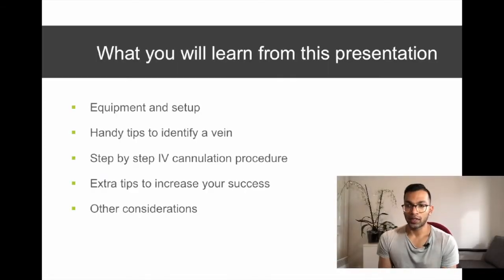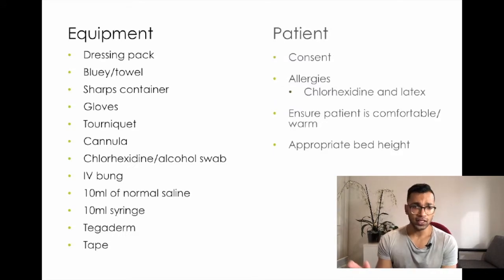So what you'll learn from this presentation: we'll go through a lot of detail with the equipment and setup, handy tips to identify a vein, a step-by-step IV cannulation procedure, some extra tips to increase your success, and a few other considerations. So here's a pretty exhaustive list of the equipment that you may need to use.